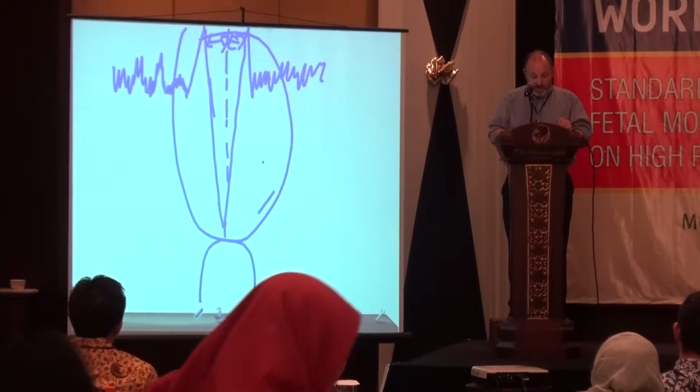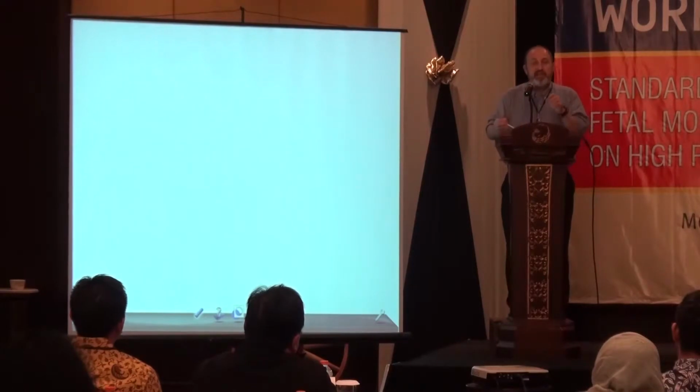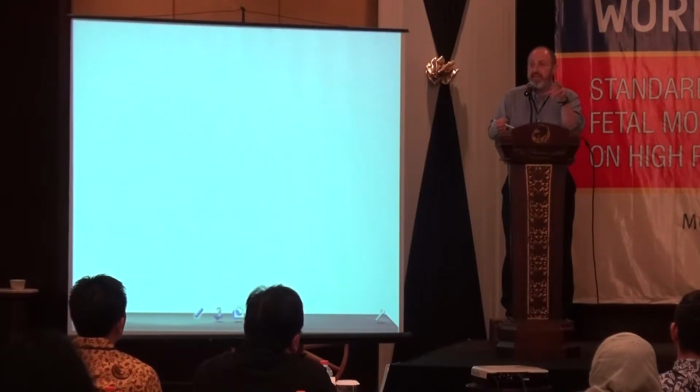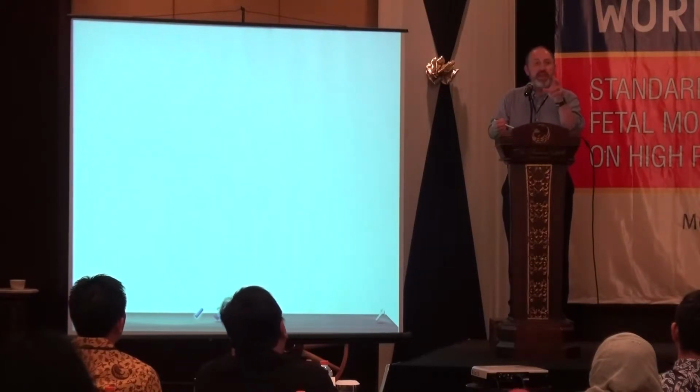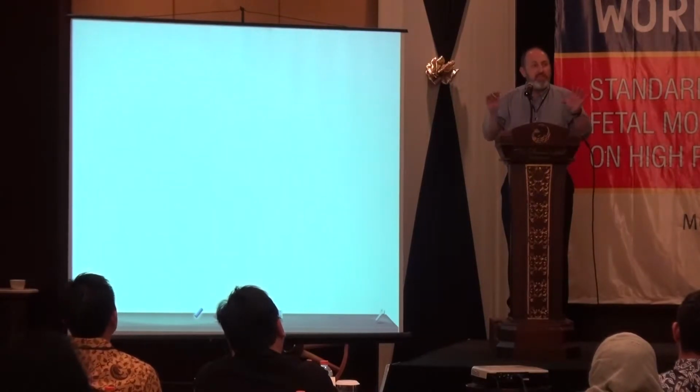Yeah? There's sometimes an assumption that for something to be a variable deceleration, sometimes people think that a variable deceleration is the presence of earlys and lates. Some earlys and some lates makes the pattern variable. Have you heard that being said? Sometimes? That's not the case.